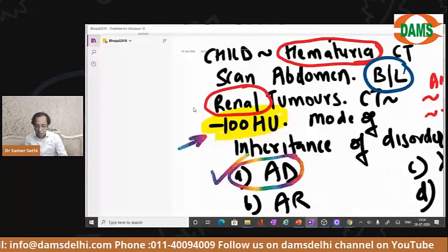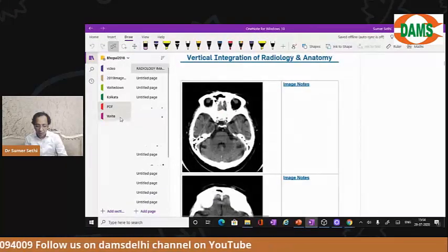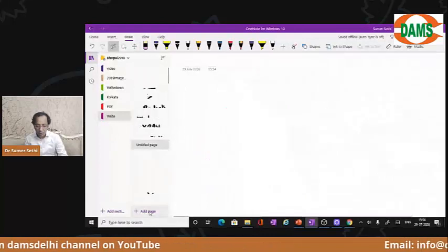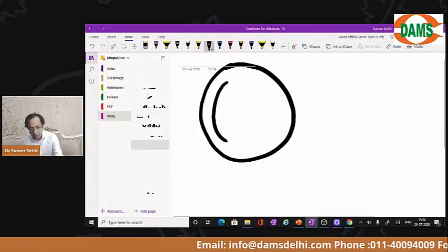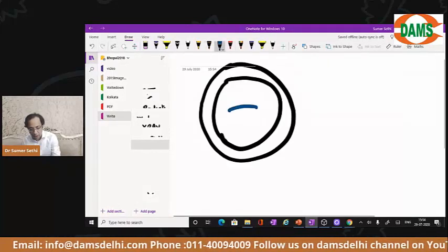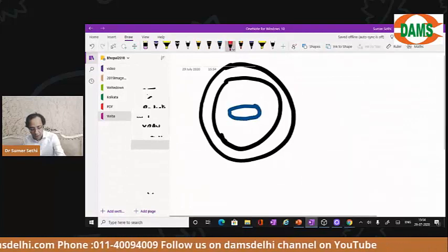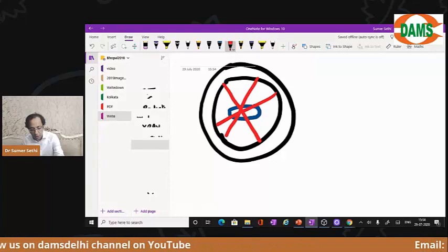Okay, very good. Once I see all of you are able to understand, I will now quickly switch over to an image, because we have some idea with us. But one more thing to understand is this is how a CT scan machine is, and this is where your patient is. The X-ray beams are passing through the patient at different angles.